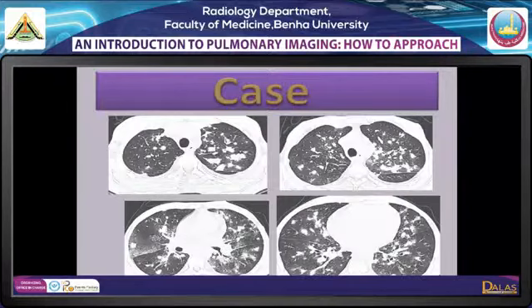Okay, the third question, Dr. Yosria: is there a definite sign to differentiate subacute hypersensitivity pneumonitis from COVID-19 on a radiological basis alone?